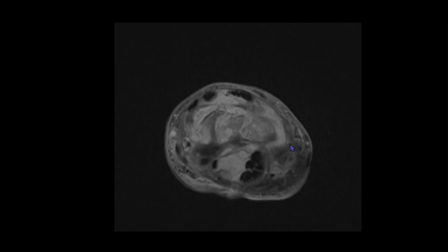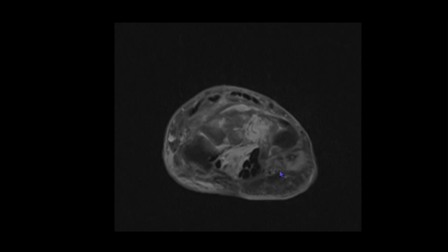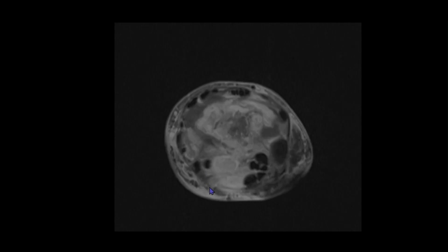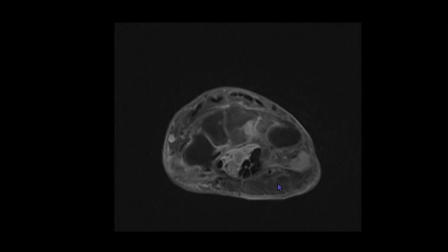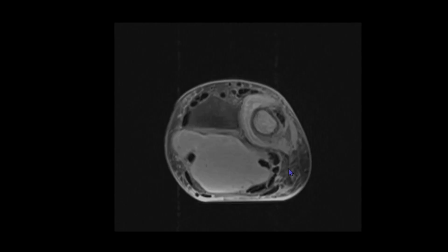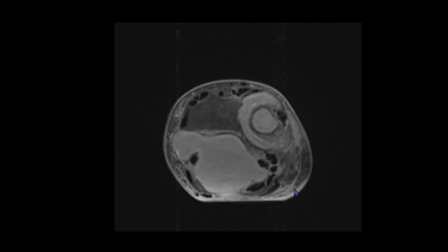In the same way, in the region of the hook of hamate, we'll be seeing the ulnar nerve. So in this region the ulnar nerve should be there, and this is the ulnar nerve. If we trace the ulnar nerve proximally, we see that this nerve is also displaced by the collection and has been compressed because of it. So we need to see the vessels as well as the neural structures which pass through this region.